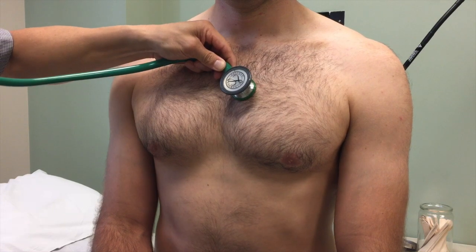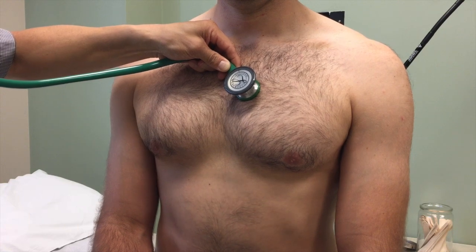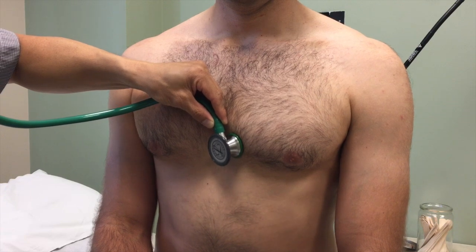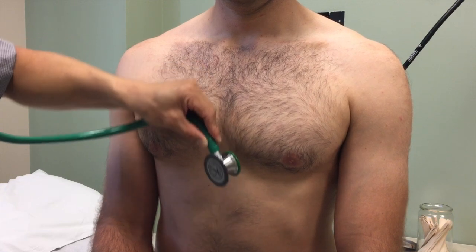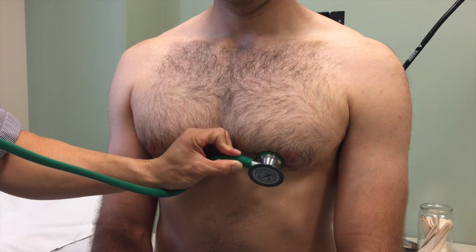Next, you'll want to repeat the exam with the bell of the stethoscope in the same areas as you did for the diaphragm. Be sure when using the bell of the stethoscope to apply as little pressure as possible to create a seal.